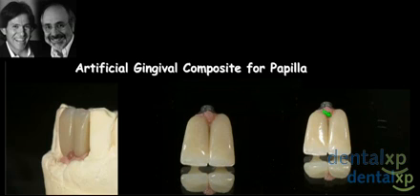And David, this is something that's done with composite resin. It can be done chairside, a direct technique, rather than having to do it with porcelain, pink porcelain. But the whole idea here from a prosthetic aspect is that trying to get someone to do really beautiful porcelain like this is difficult. So we tell them to idealize two teeth based on the adjacent teeth, ideal form, and we come back. If they put a little bit of pink porcelain in there, that's fine.